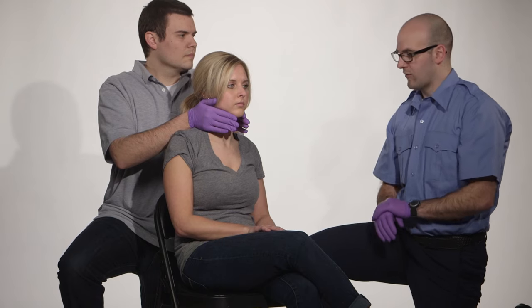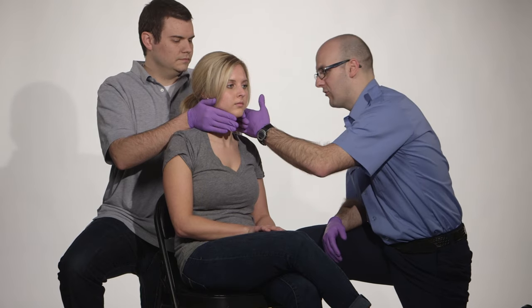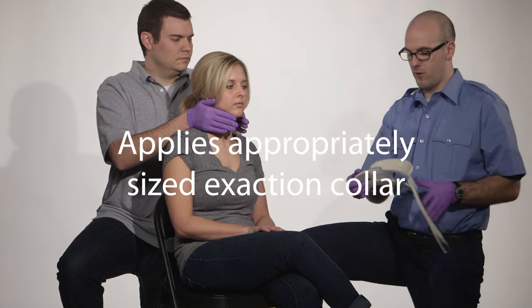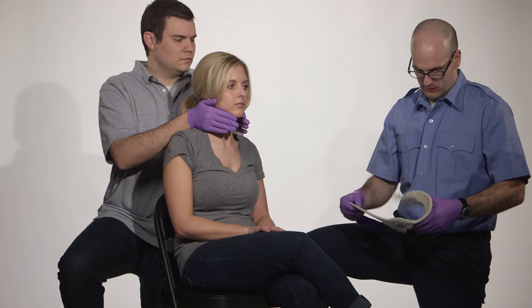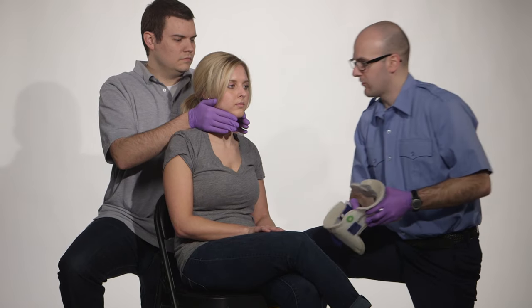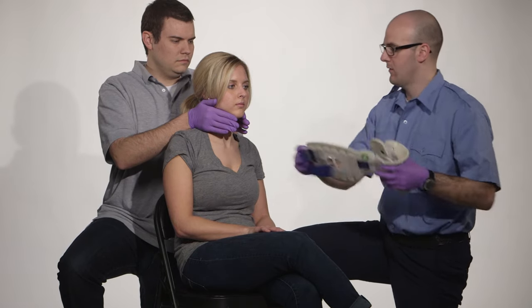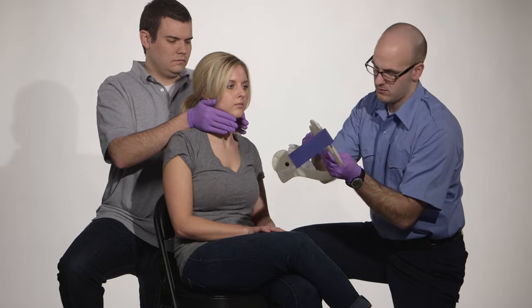Now that CMS is complete, I'm going to size my patient for a C-collar. Select the appropriate size, reform my collar, and apply my C-collar.